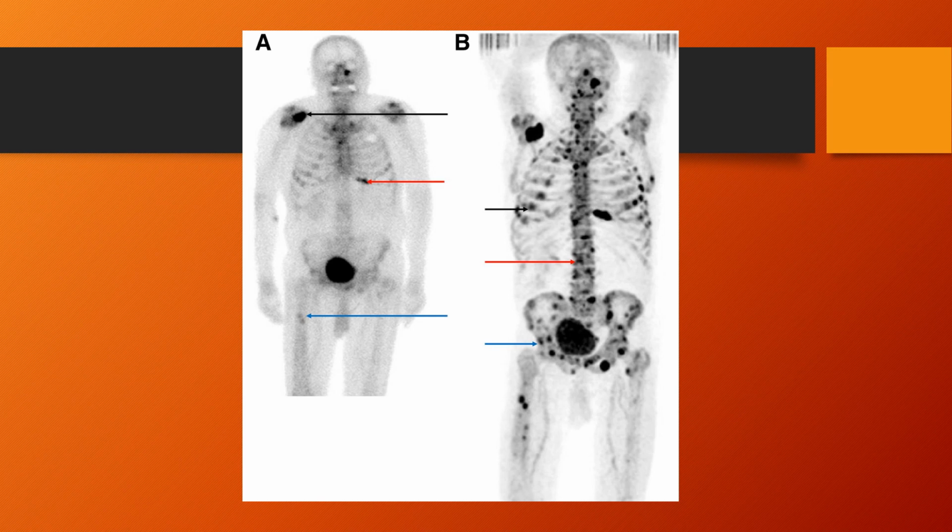This is an example of where the sodium fluoride is much more sensitive to changes in the bone and bone breakdown and bone development than the MDP is. Part of this does have to do with PET imaging and just the spatial resolution and the sensitivity of PET scans and just the image quality that you get in PET versus the planar imaging with tech-based agents. But it also has to do with the difference that one is a phosphate and one is fluoride. But a lot of it has to do with just being PET imaging.